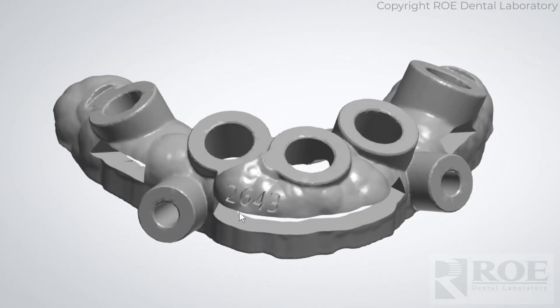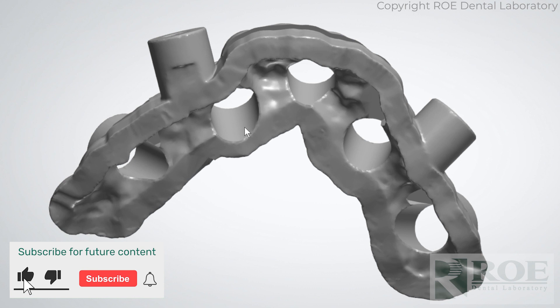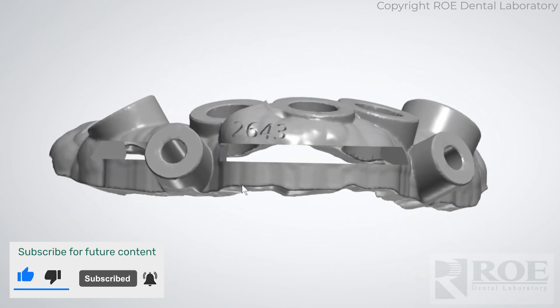This video will discuss the bone channel guide. The bone channel guide is a bone-supported guide. It just rests on the bone only, not on teeth.